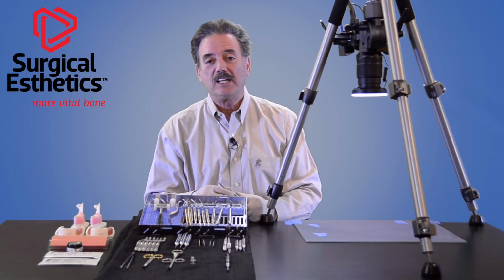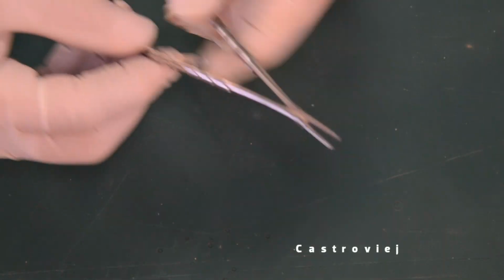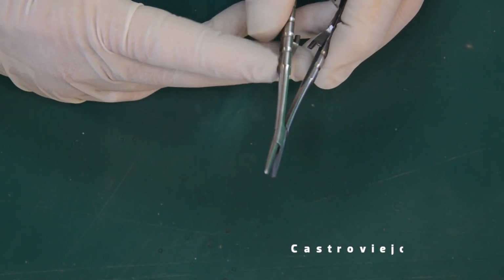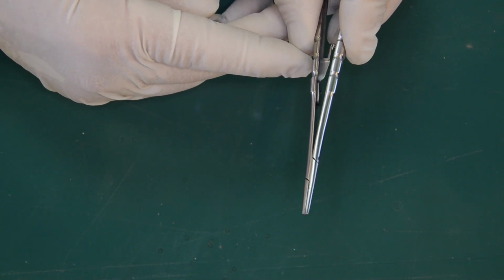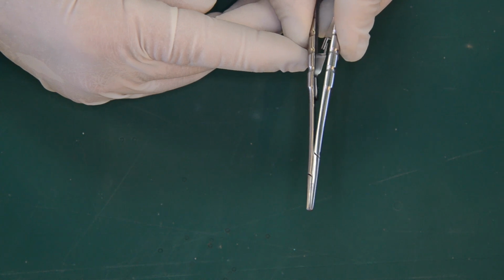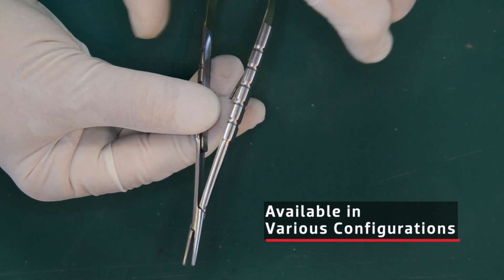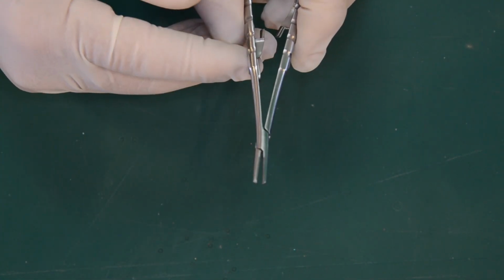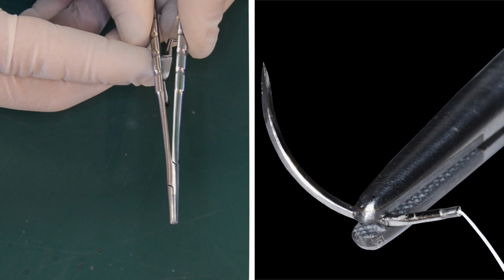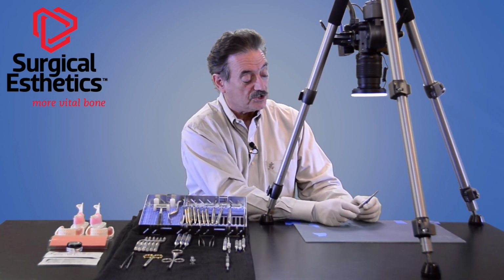Our next instrument is what I consider a can't-live-without instrument, and that's a Castroviejo needle holder. The Castroviejo enables you to handle the needle to do suturing in a way that a typical hemostat type device doesn't allow you to do. It takes one small squeeze and it grabs the needle, the next squeeze and it releases the needle. And you can see that can be done very effectively without the tip of the instrument moving at all. If you're using your typical hemostat and you're squeezing it, it's almost impossible to keep the end of that instrument stable, which means it's very easy to tear the tissue when you're trying to navigate the needle through delicate tissue. So again, with the Castroviejo, one small squeeze, it grabs the needle, second squeeze, it releases. Critical to being able to do these procedures effectively and handle the tissue well.